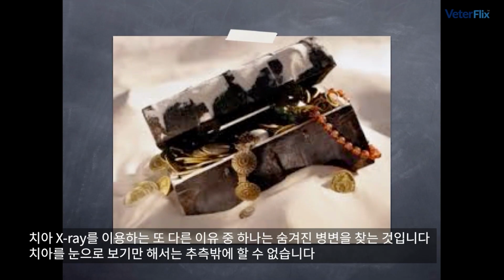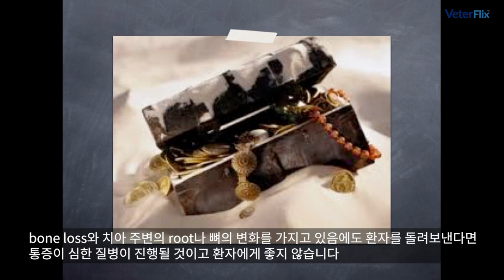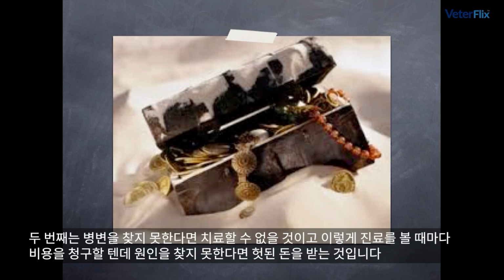One of the other reasons for dental radiology, we are finding that there's a lot of hidden pathology that just looking at a tooth, we're guessing. Most likely we are missing pathology that is present there, and that's bad for two reasons. Number one, it's poor patient care. If we send a patient out the door with bone loss and with changes in that tooth, around that tooth, and in the roots and the bone around that tooth, those are painful processes, and they're going to progress, and that's not good for the patient. That's just poor patient care.